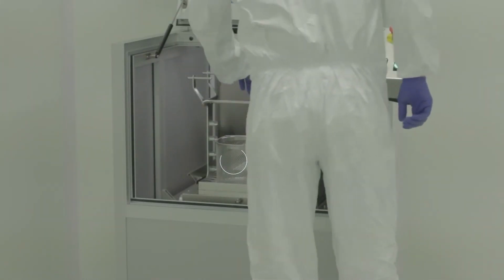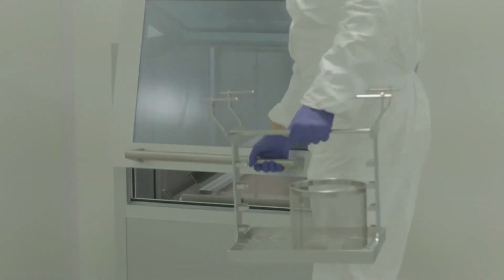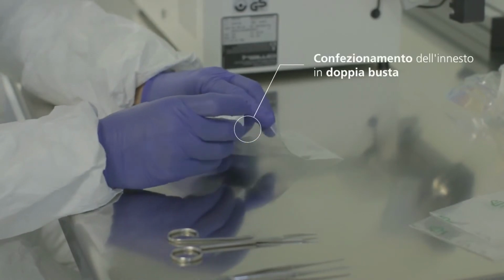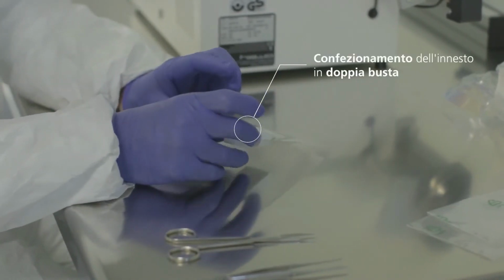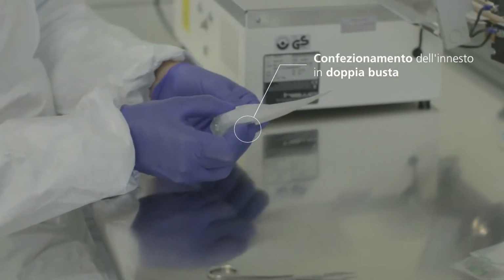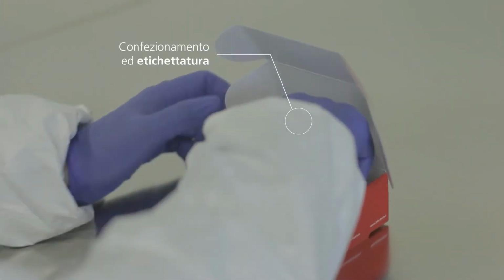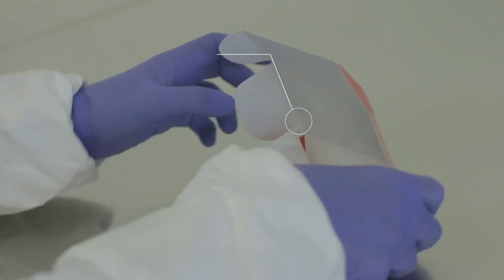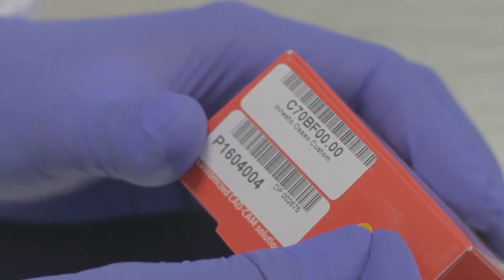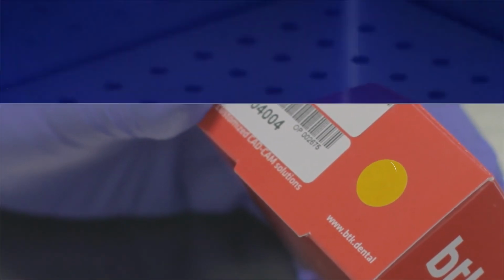The dentist not only receives the scaffold, but also receives a replica of the scaffold that is extremely useful, first to test the adaptation of the scaffold onto the bone anatomy of the patient. Second, to handle the soft tissues well. We know very well that we have to make a tension-free suture in order to have success in this procedure, because if we have tension in the suture, there's a huge risk of dehiscence and then infection and failure of the scaffold. So we can play with the soft tissues very well thanks to this replica.